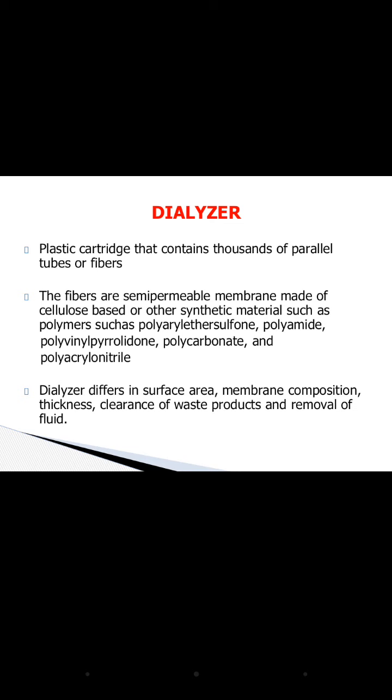These are made up of cellulose or synthetic material, that is polyarylethersulfone, polyamide, polyvinylpyrrolidone, polycarbonate, and polyacrylonitrile. But the dialysers differ in surface area, membrane composition, and thickness.